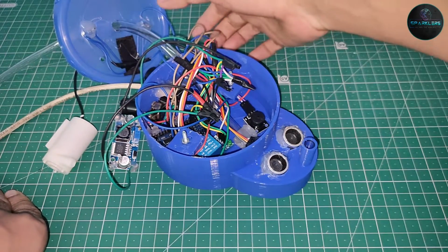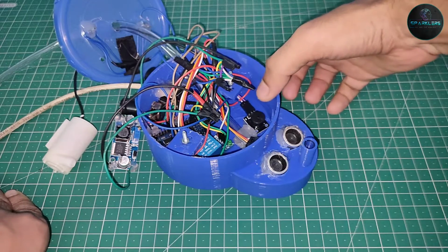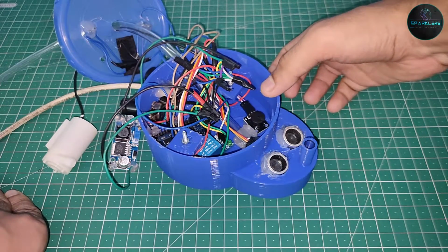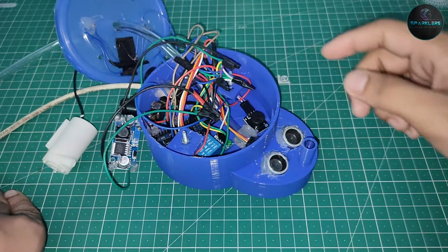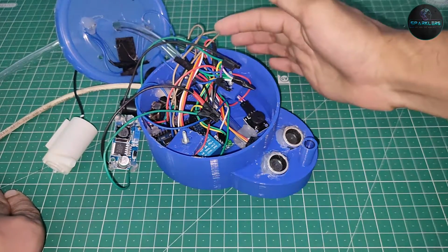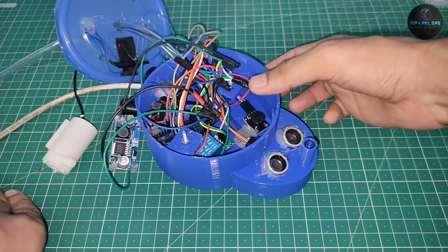For the LEDs, connect the ground with the ground of the power supply, and same for the buzzer. Now for the positive one, connect the positive of the LED with a resistor. In my case I have used a 100 ohm resistor, so connect with a resistor and then connect it with any of the pins in Arduino. In my case I have connected it with pin number 7.